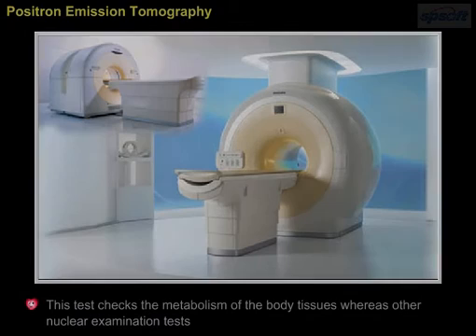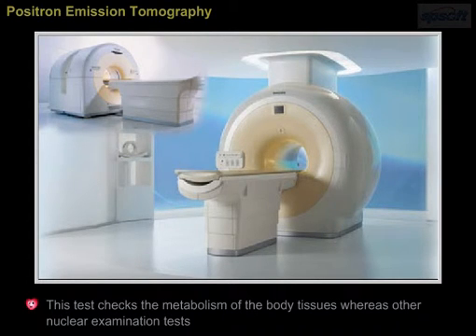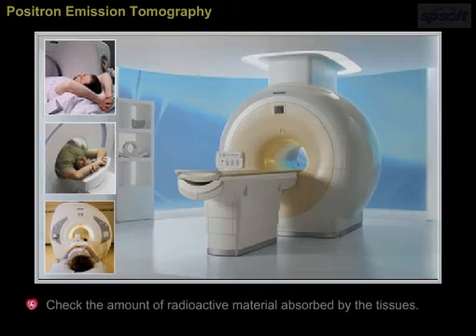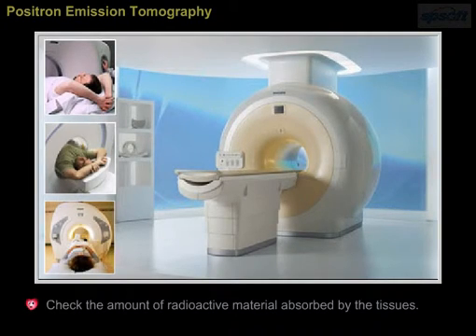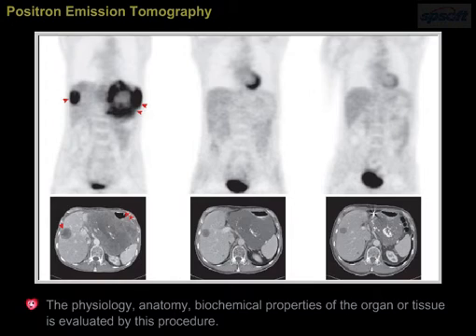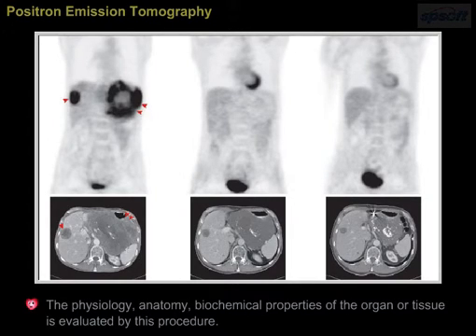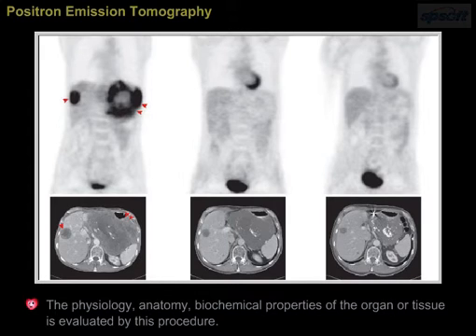Positron Emission Tomography. This test checks the metabolism of the body tissues, whereas other nuclear examination tests check the amount of radioactive material absorbed by the tissues. The physiology, anatomy, and biochemical properties of the organ or tissue are evaluated by this procedure.